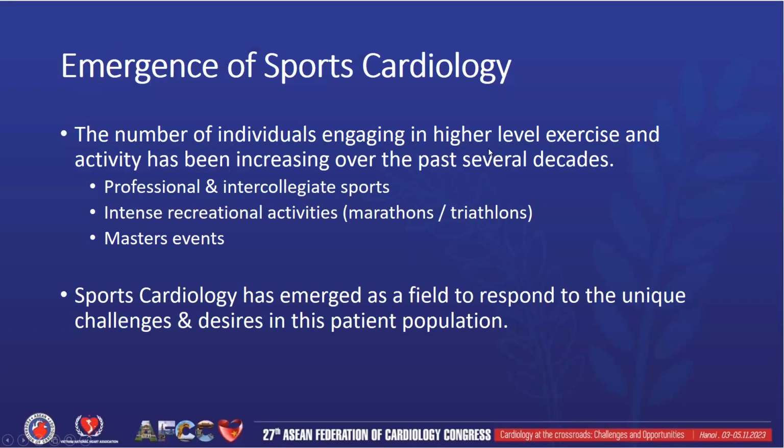So the first half of this talk is going to be talking a little bit of an overview about sports cardiology, and then we're going to get into more specifically, having to do with echo assessment of athletes. And I think to understand the exercise-induced cardiac remodeling process is essential for us to be able to properly interpret the echocardiograms that we see in these athletes.